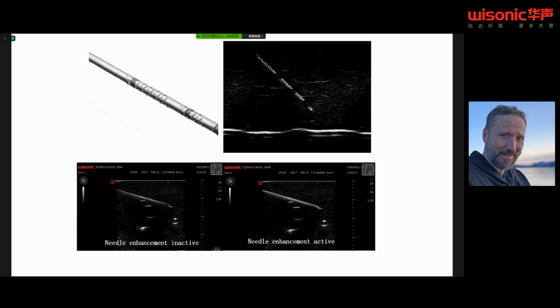What can we do to reduce the risk of such collateral damages? We do not want to puncture the lung or vessels or vital organs. Well, most of all, it is important to have control over the needle, and we have to be able to visualize the needle and the needle tip all the time. And there are some helpful technologies.